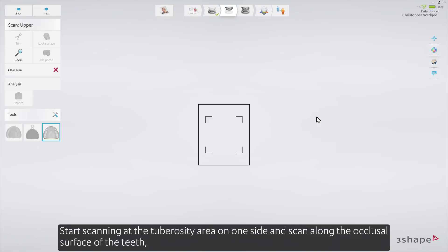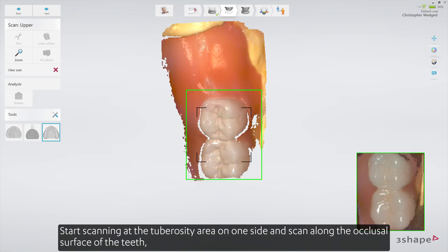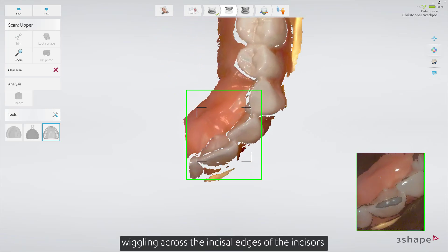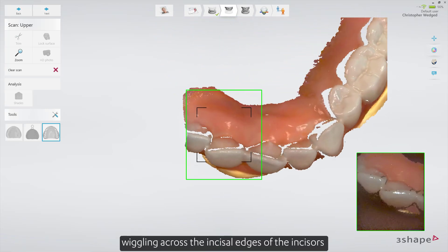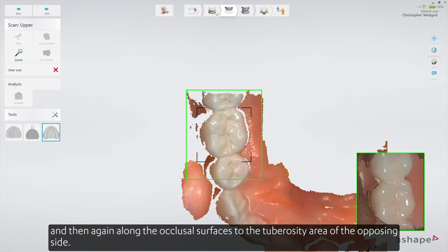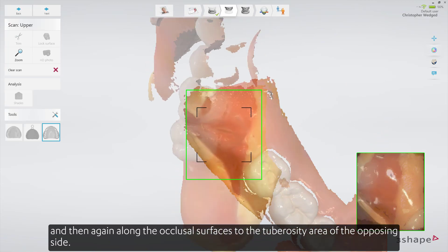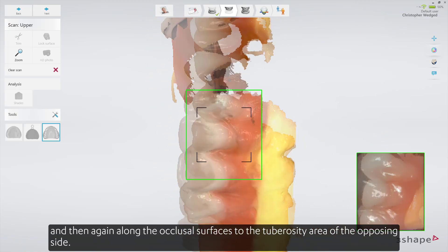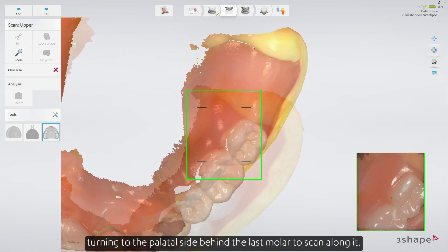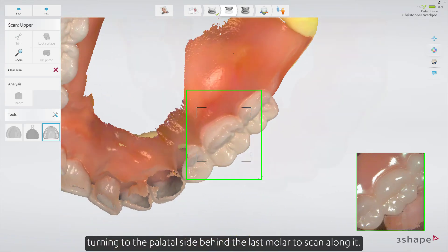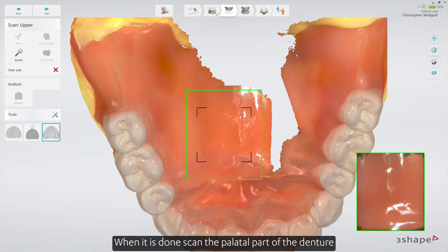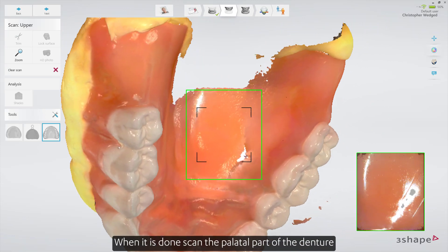Start scanning at the tuberosity area on one side and scan along the occlusal surface of the teeth, wiggling across the incisal edges of the incisors and then again along the occlusal surfaces to the tuberosity area of the opposing side. Then scan back along the buccal aspect of the denture, turning to the lingual side behind the last molar to scan along it. When done, scan the palatal part of the denture.